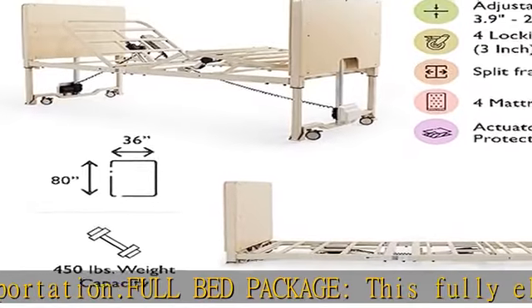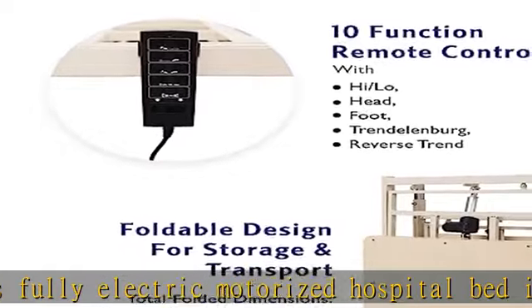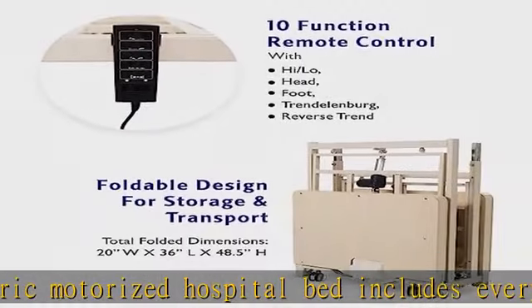Lightweight — it weighs 42 pounds and has a weight capacity of 450 pounds. The deck is split spring, with both a head spring and foot spring.